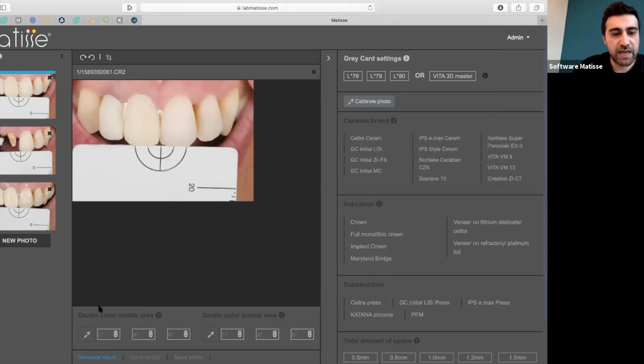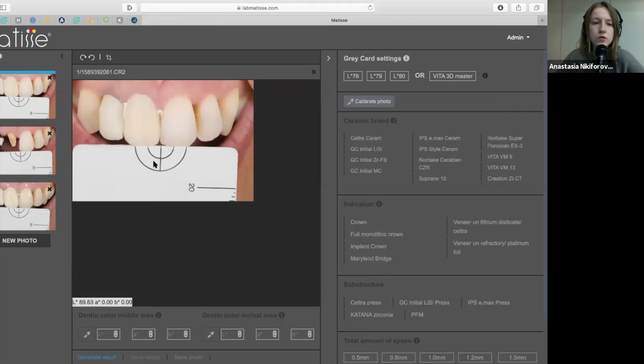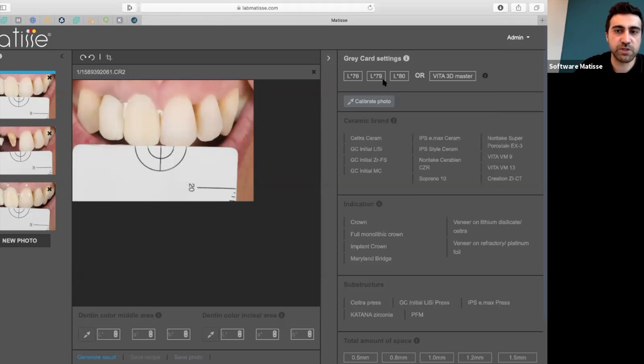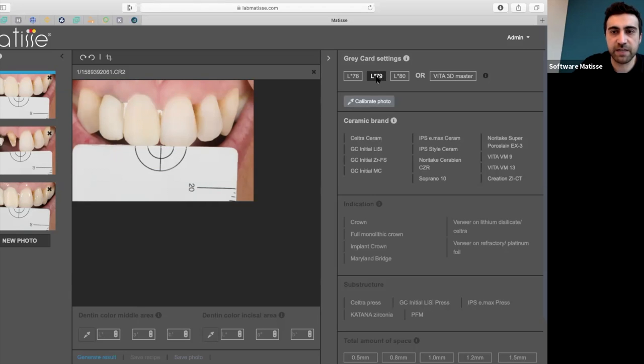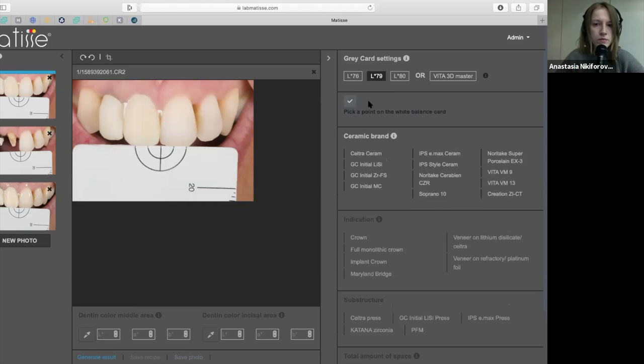So in the left corner here we have our digital color meter. This white balance card has a luminosity of 79. So we have to bring the luminosity to that value, as you can see here. We click on L79, then Calibrate photo.